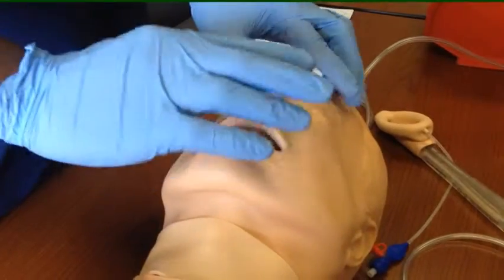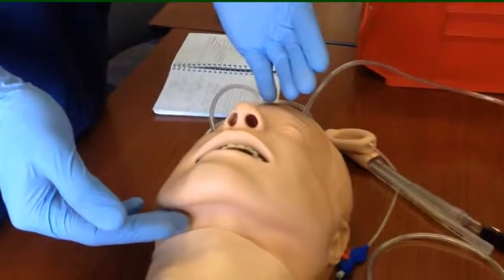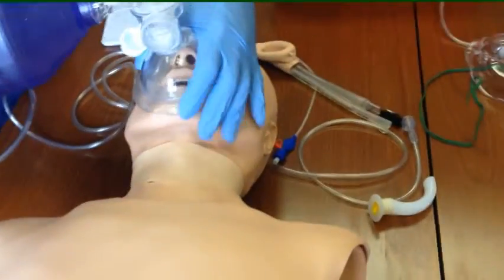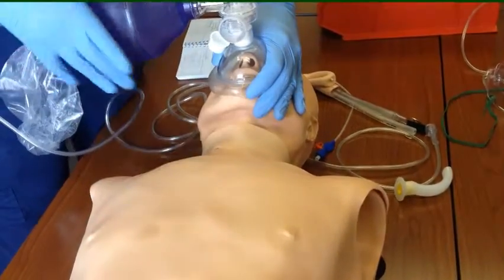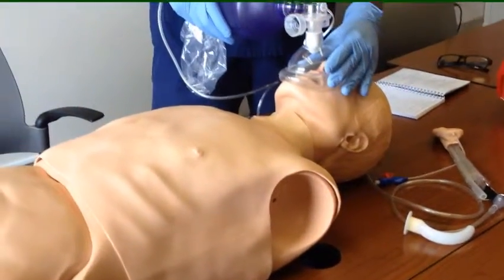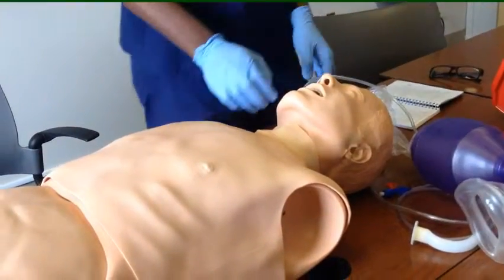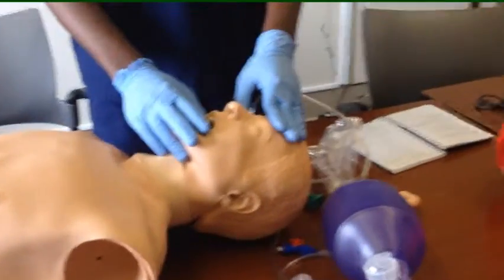If we put our NPA in the right location, it should be taking the tongue all the way off from the back of the throat. And that means when we start bagging this patient, we know that it's in the right place. We shouldn't be facing any resistance. And as you can see, the more I bag, the more we see the chest rise. So that means we have our NPA in the right position, and we are achieving our purpose of providing air support to our patient.